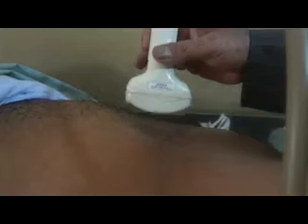I will then angle the probe and pivot it to get my desired view of the structure I want to study, which in this case is the portal vein.